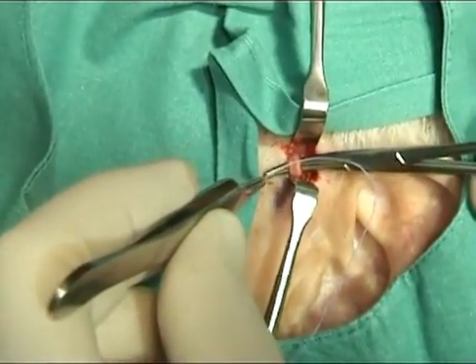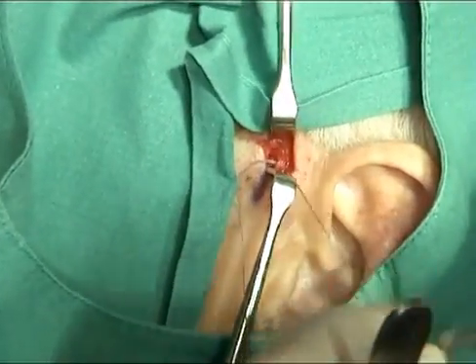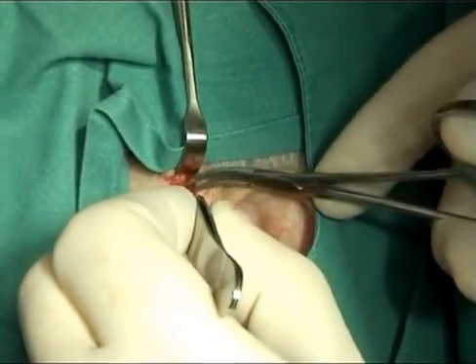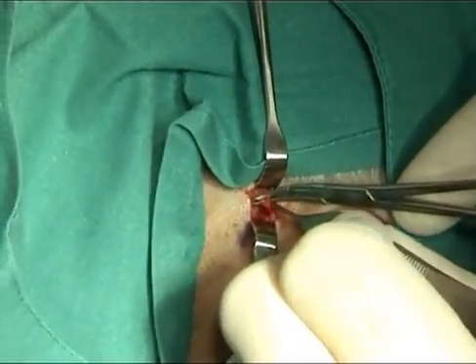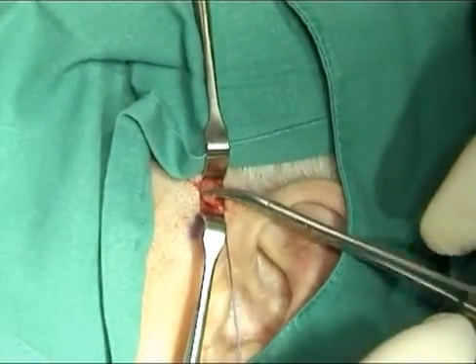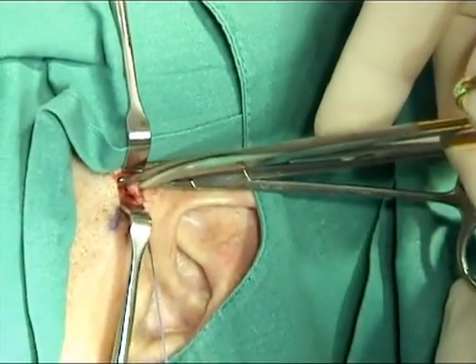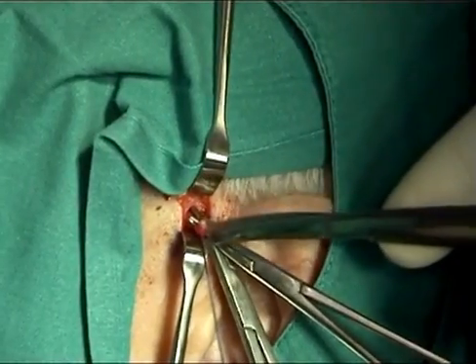Once identified, a ligature is placed to provide traction. The two ends of the artery are then clipped and a segment of artery is removed.